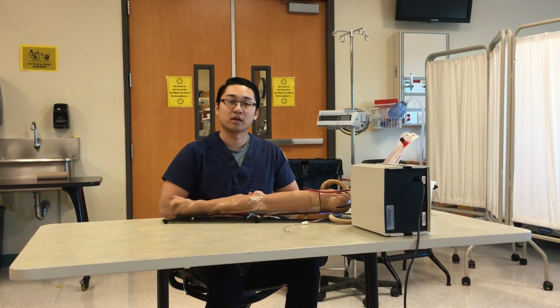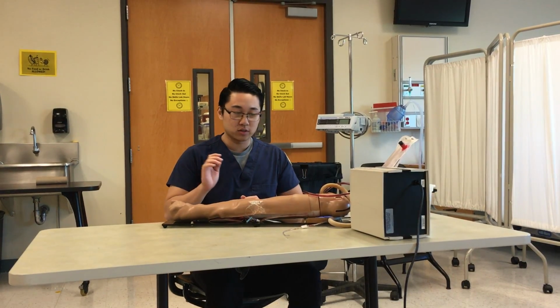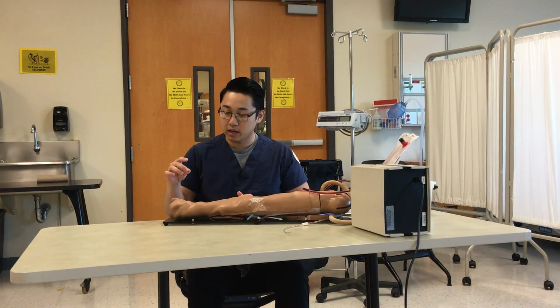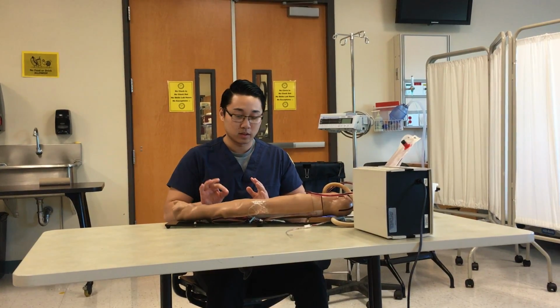Secondly, I will check the patient's charts. I will look at the oxygen device that he or she is on, the FiO2 setting, and how long the patient has been on that device and setting. I will also look at contraindications such as arterial shunts or grafts. I'll look at any negative Allen's tests, and I'll also check to see if there has been any anticoagulants given to the patient. This could be problematic because they will not clot at the point of where I stick them, so they need to be able to clot their own blood before I can stick them.